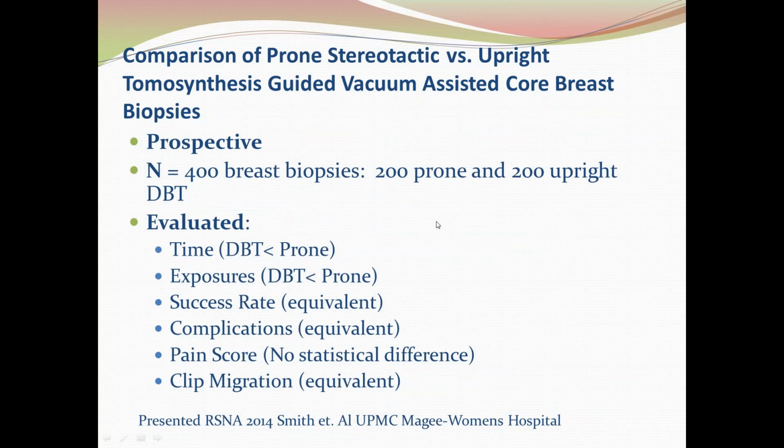Our group presented an abstract at the RSNA in 2014 where we did a prospective study. We looked at 400 breast biopsies, triaged to either prone biopsy or upright biopsy. And we looked at many of the same features that Dr. Kuhl did in her study.